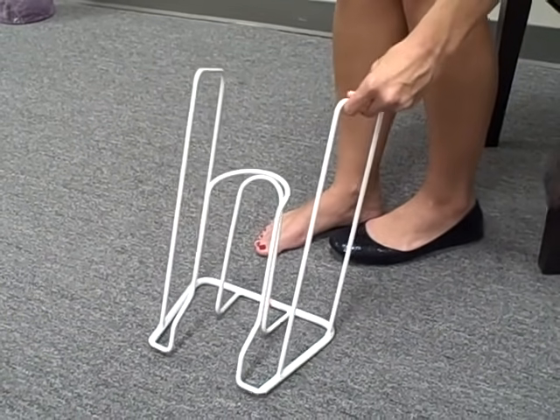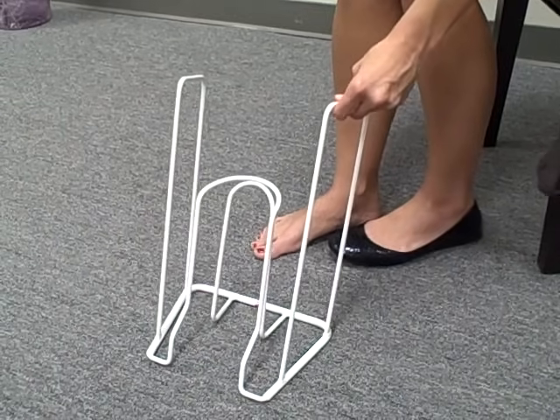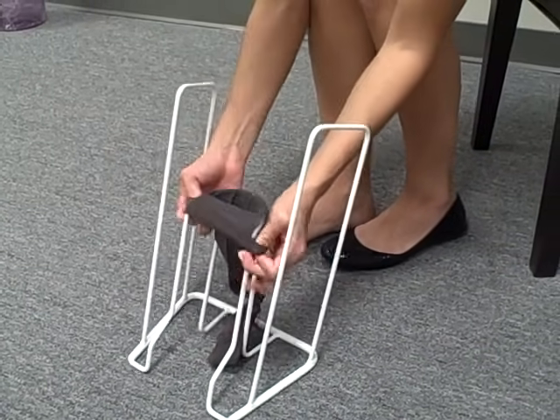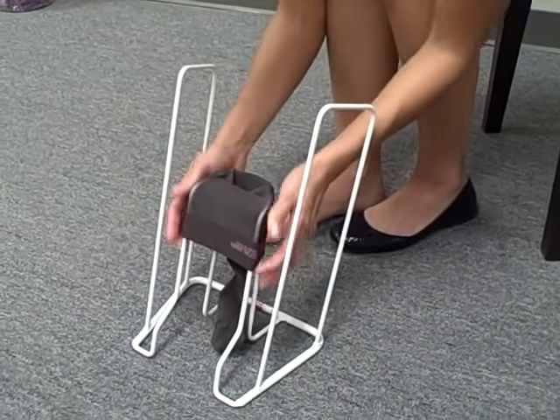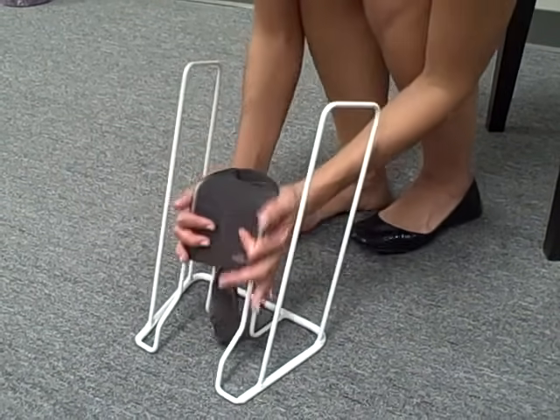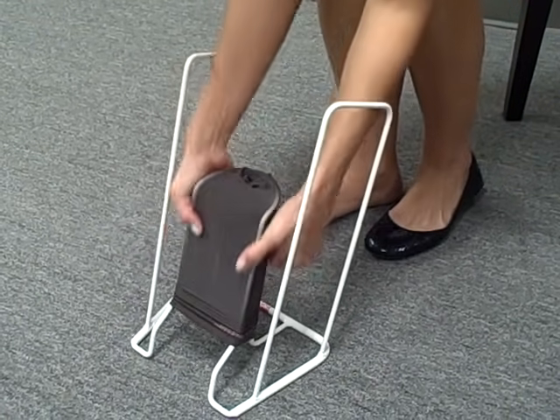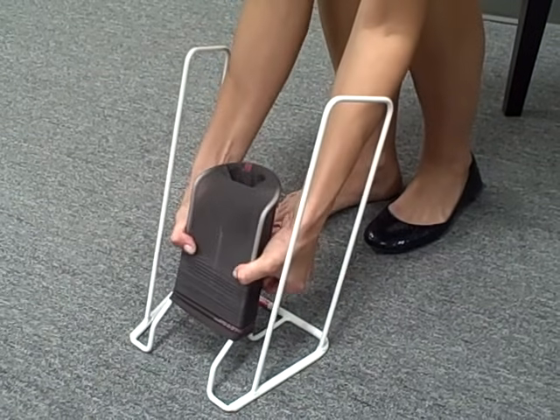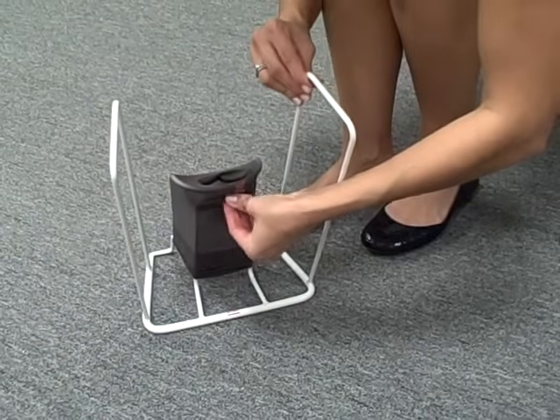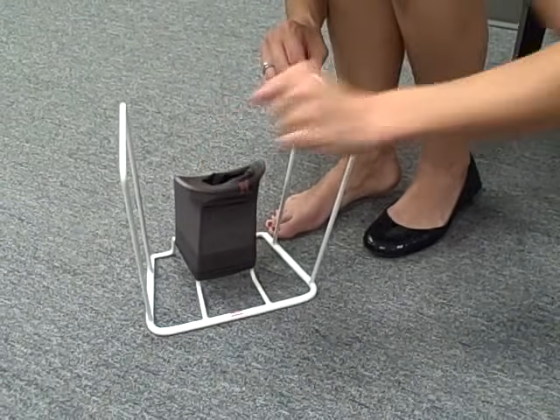To use this butler donning device to put on your compression stockings, start by rolling the top of your compression stocking over the top of the butler. Using the palms of your hands and avoiding your fingernails, roll the stocking down over the device until you have the heel rolled over the device facing you and a nice toe box area formed.